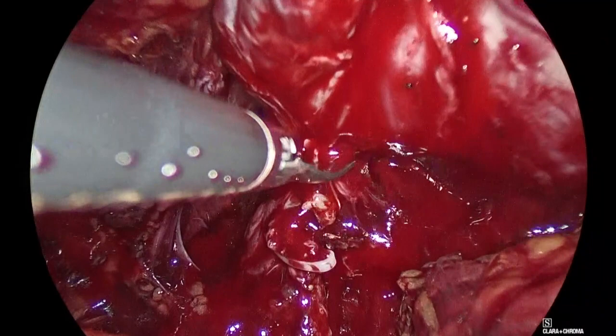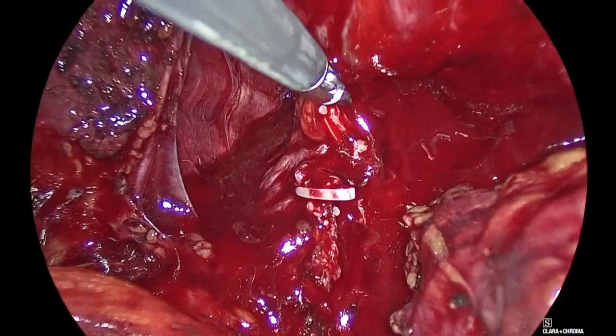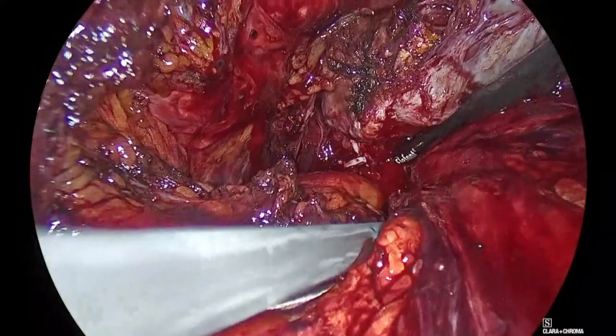Do you never have problems with Hem-o-lok clips not closing because you don't prepare your clip zone before clipping? Many times you have problems with Hem-o-lok clips. Go back. Aspirate there, Panagiotis. But the problem has to do with two things. It has to do with the clip applier. If the clip applier is old, go back. Okay, show me my side, Panagiotis.